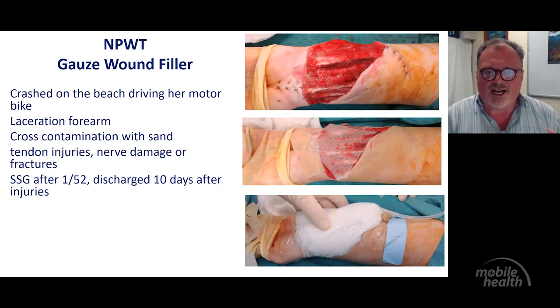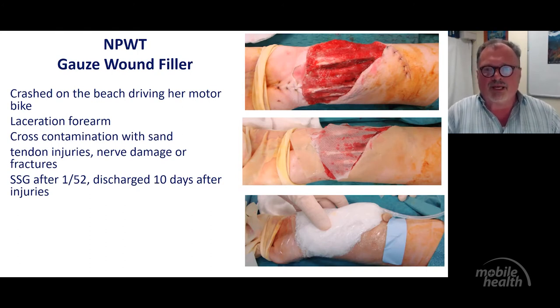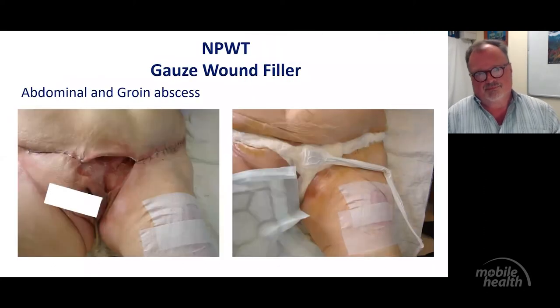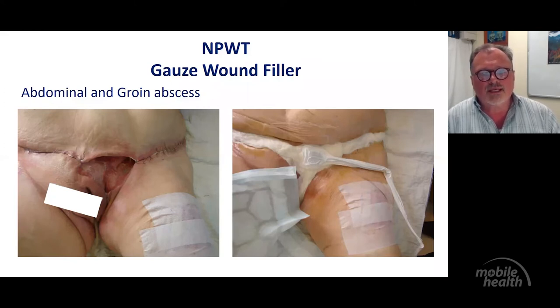So it was just the time when we had trialed the gauze systems. And you can see it's way before we had new tracking pads, all right? It was a bit cumbersome to apply, but it performed really well on that wound. And the patient was discharged after a split skin graft after a short period of time. So it did really well. Pain wasn't an issue, and there was no problem with any of the underlying structure of the wound. And that was encouraging. So when you have tricky areas like this groin and abdominal abscess here, we also tend to use a gauze. For this area, it was very good because pain was an issue there, and it performed very well.